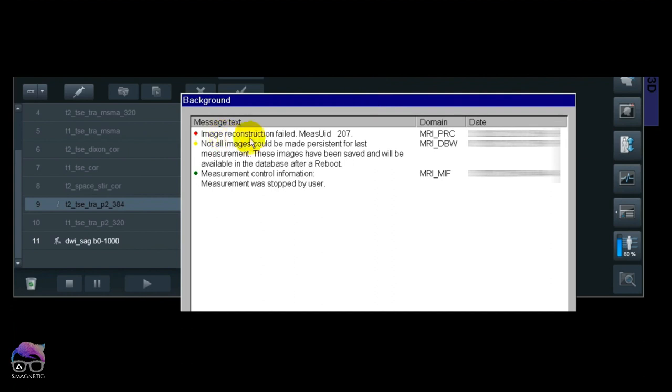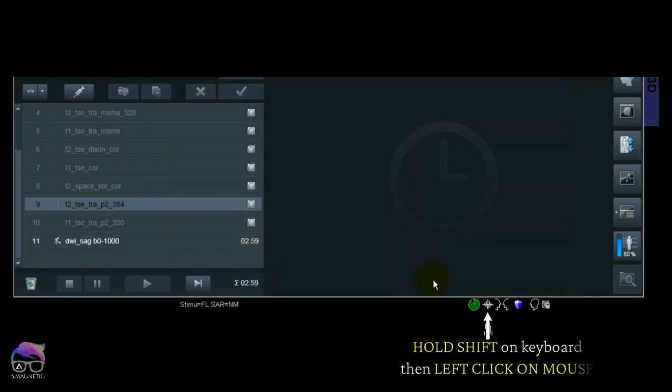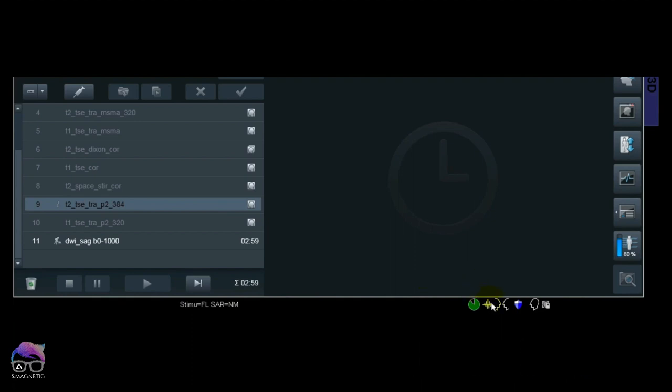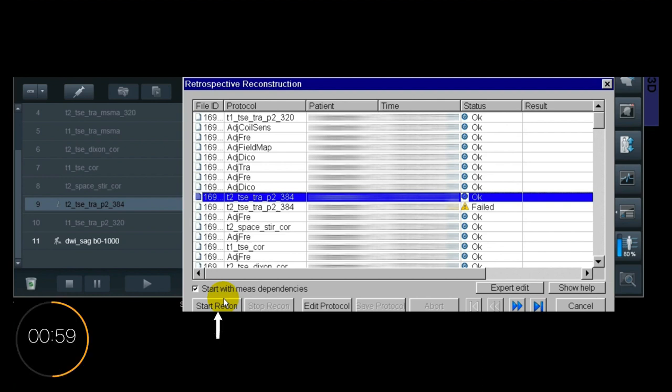Let's close the message. You see down there you have some kind of echo icon. If you hold down the Shift button on the keyboard and left-click with your mouse, you come in here—retrospective reconstruction. Locate the error sequence and you can start recon. But it's important that you don't have any ongoing sequence scanning.